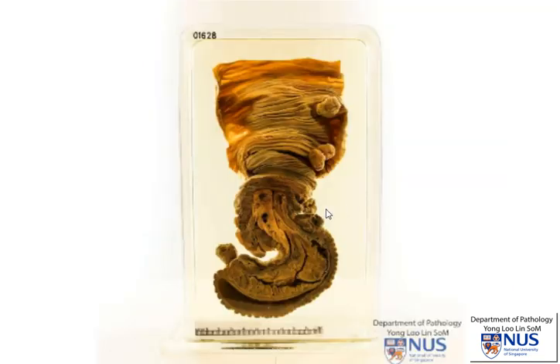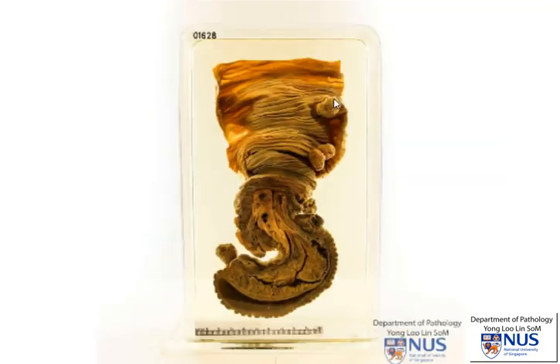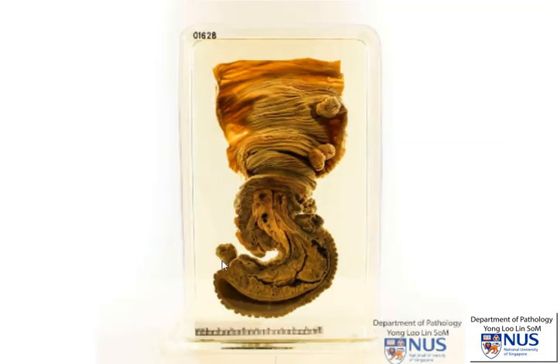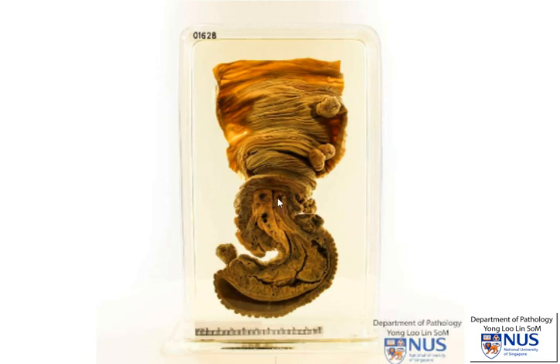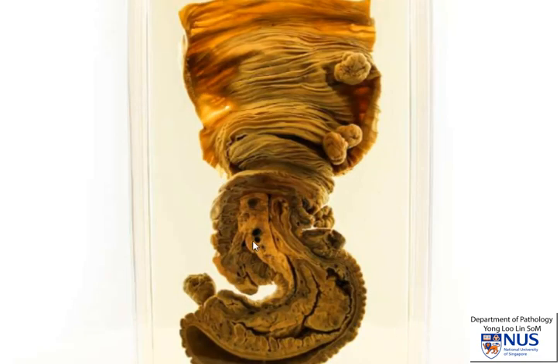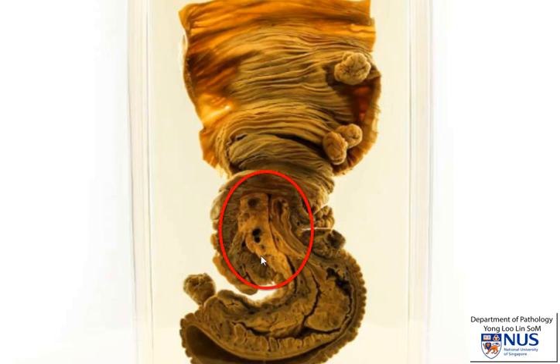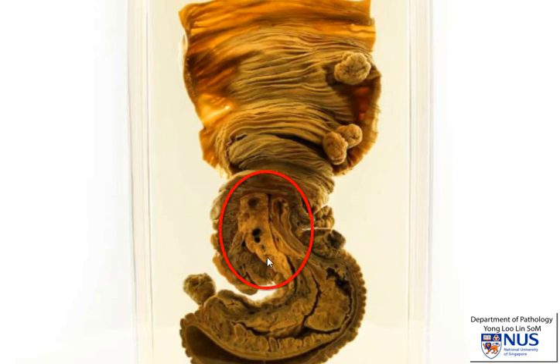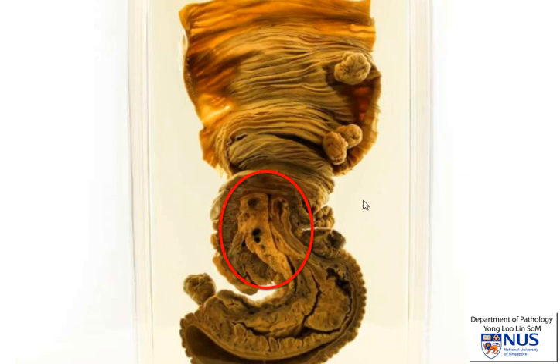Here is yet another example of a colon with several polyps. This is the area of intussusception, and we can even see that the vessels are very congested in this area of compressed mesentery.